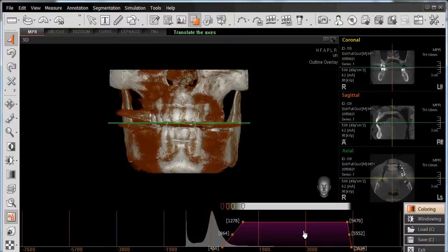From here, a scale appears at the bottom of our window. You'll note the orange numbers along the bottom of our scale, such as negative 1900, positive 1900, 3800, and so forth. Referring to the Hounsfield scale as a reference, where distilled water at room temperature would be zero — any density greater than the density of water will have a positive number, and any density less than the density of water will have a negative number. In this case, air has a value of negative 1000.